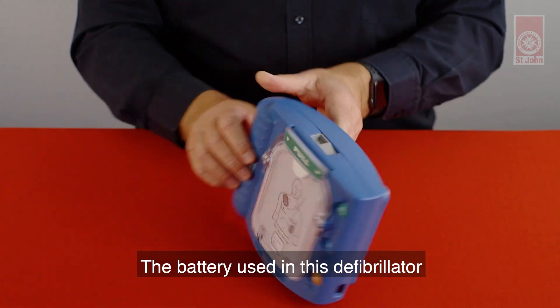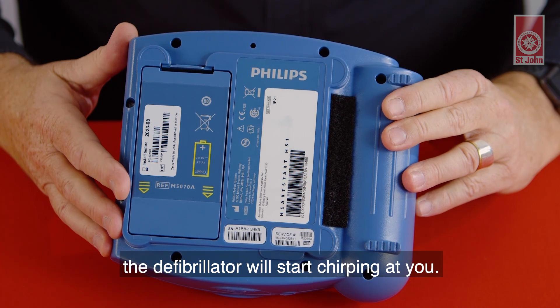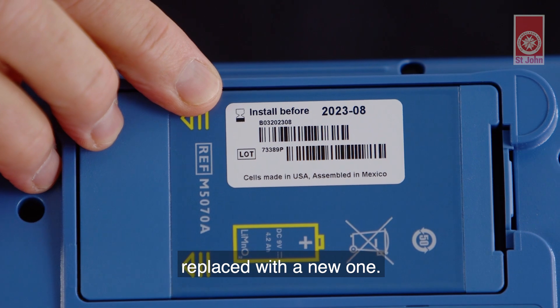The battery used in this defibrillator normally lasts for about four years. When battery power gets low, the defibrillator will start chirping at you. The battery is not rechargeable and must be replaced with a new one.